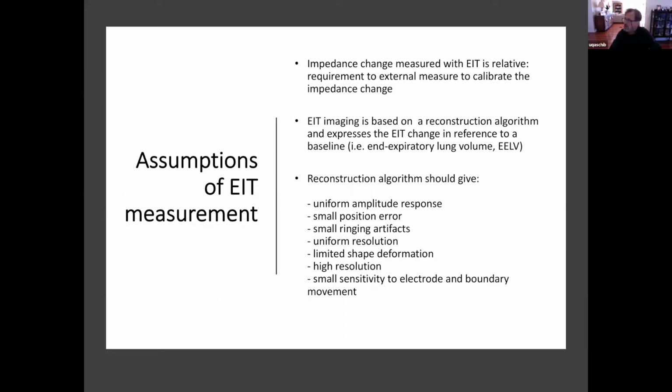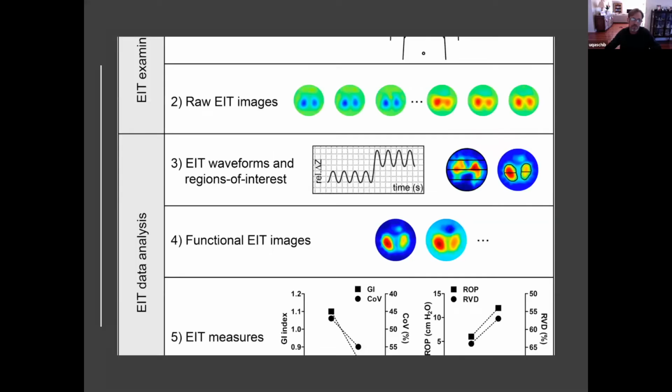Piglets work better, and even in adults, depending on the body fat composition, we may get quite a different response to voltage applied in different humans. We've got even differences between females and males, which we have to consider.